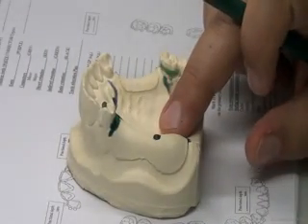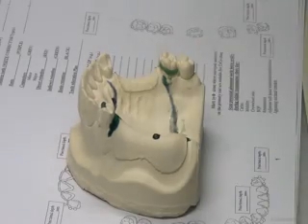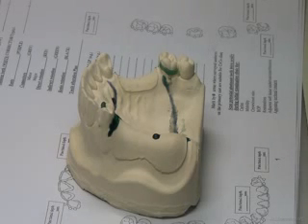The palatal strap. This is the best. Okay? We get the best support. It's the thinnest that we could produce, because it's large, I could thin it. The metal is still strong, even if I make it thin. I could mimic the palate. I am away from the gingival margins of teeth. So the best, let's say this is the very basic design.